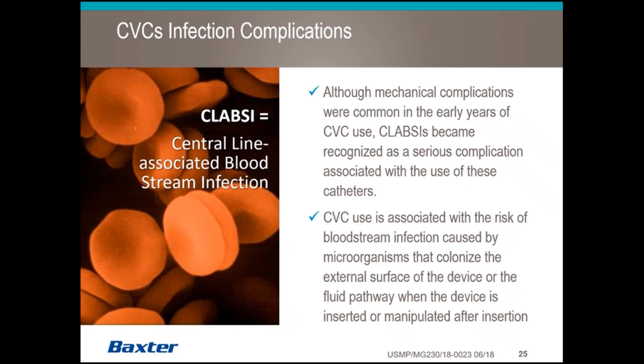Your patient needs to be protected in the form of a mask if they're not vented. There have been many times where during a dressing change or during a filter change the nurse is very well protected with PPE, but the patient is not vented and does not have a mask and is a source for a potential CLABSI. So just always remember to protect yourself, but also to protect your patient with a mask if they are not intubated.